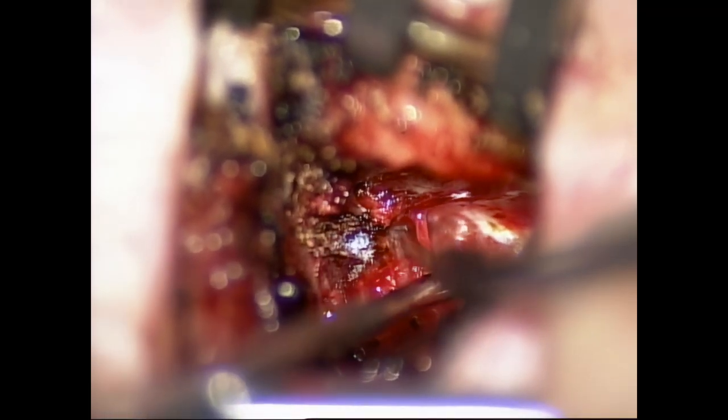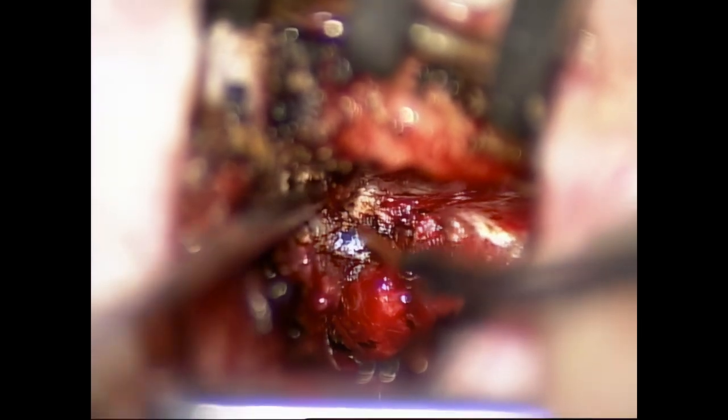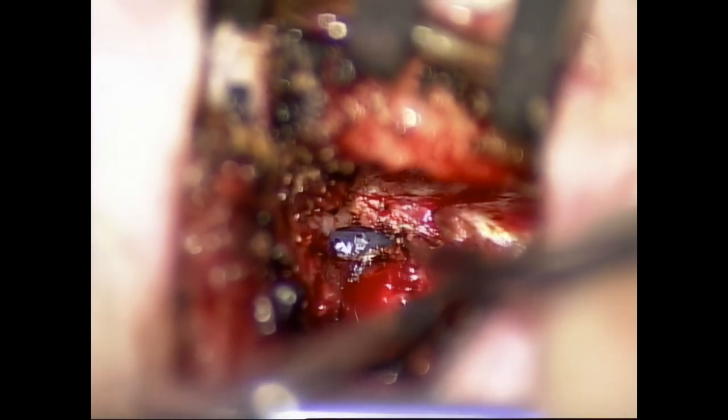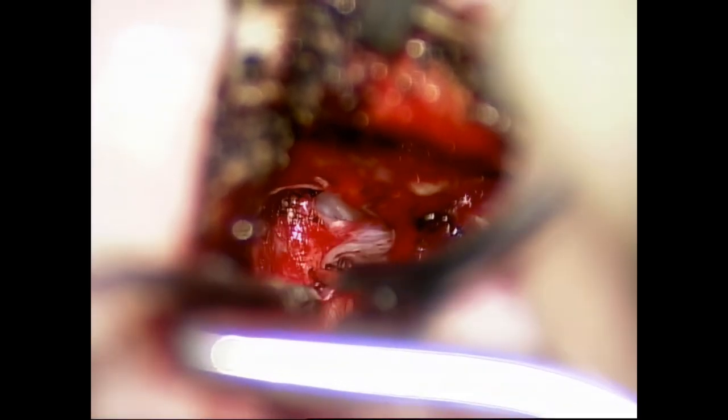So in this case, I am using a laser to debride a fair amount of the scar tissue that formed around the silicone. When there is a relatively good mucosalization, the silicone doesn't create such a dense capsule in the middle ear, but when you have to remove a lot of the normal mucosa on the promontory, you do get this dense capsule formation, not just in the mastoid, but also in the middle ear on the promontory. So a laser can be used to trim this down.